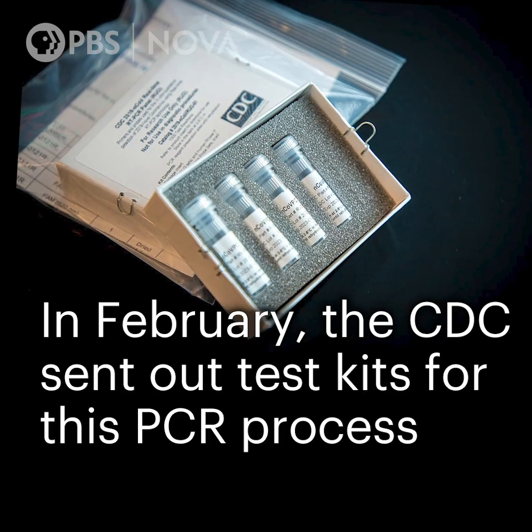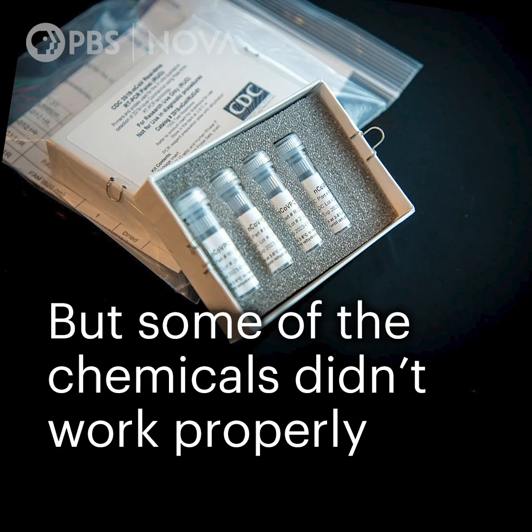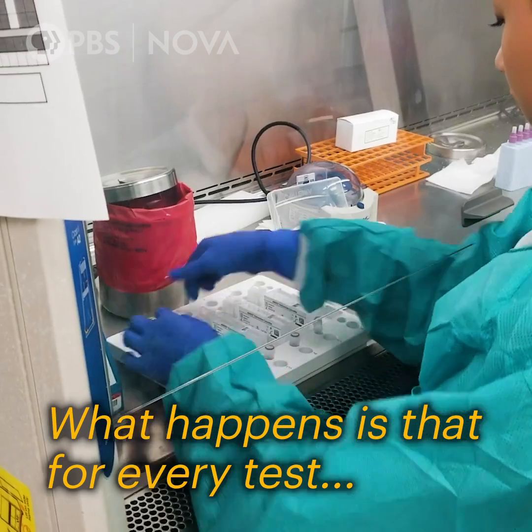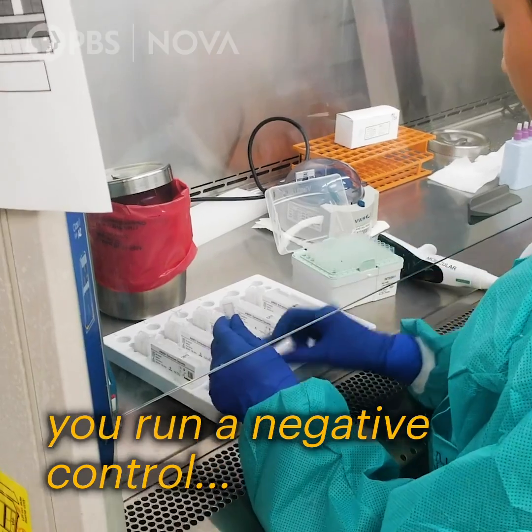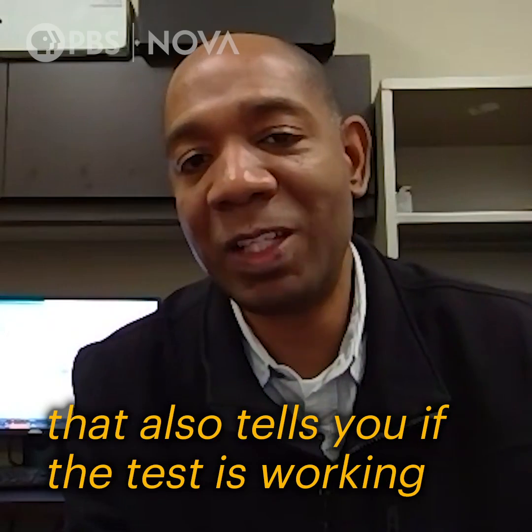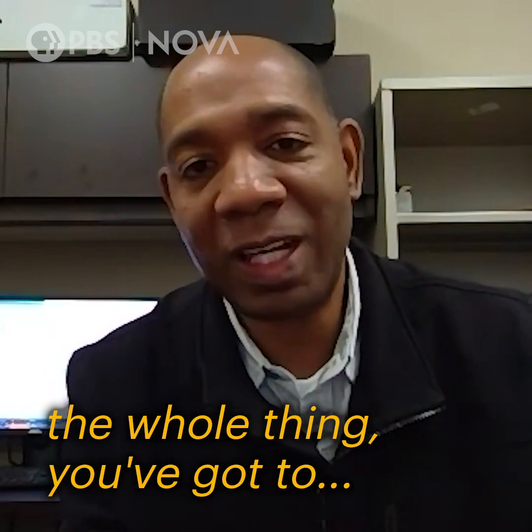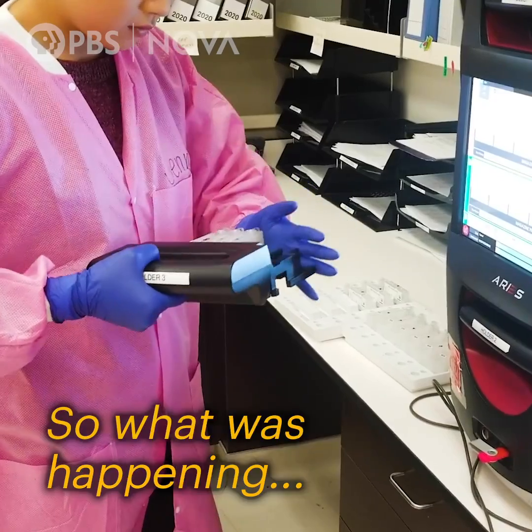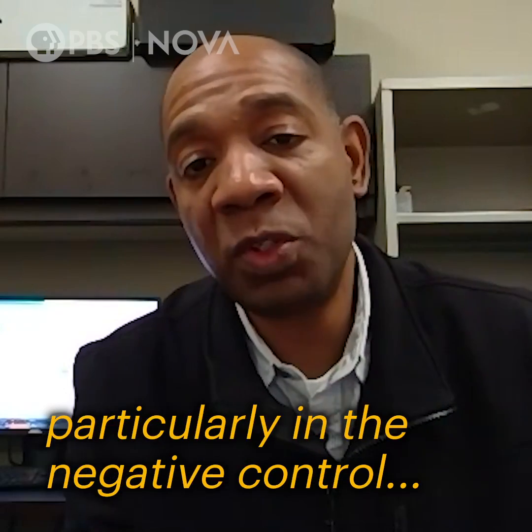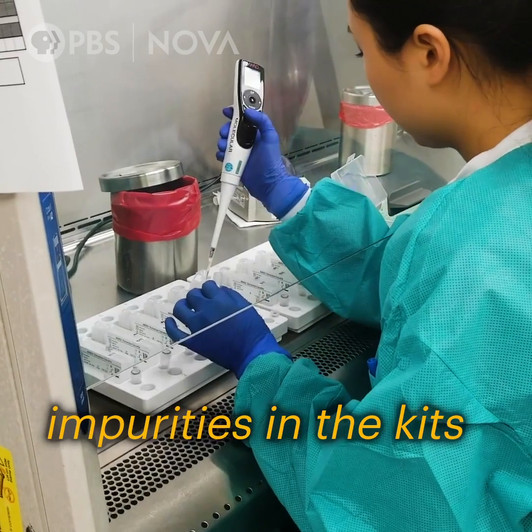In February, the CDC sent out test kits for this PCR process. But some of the chemicals didn't work properly. What happens is that for every test you run a negative control, which is a sample that's supposed to be negative, that also tells you if the test is working. If your negative control is positive, the whole thing you got to throw in the trash, basically. So what was happening with the CDC test is that there was a lot of false positives, particularly in the negative control, and that was due to impurities in the kits.